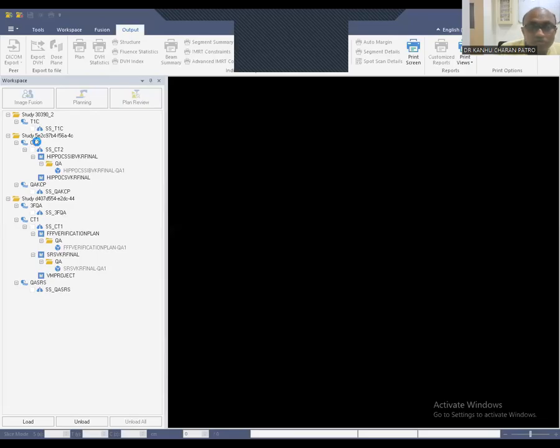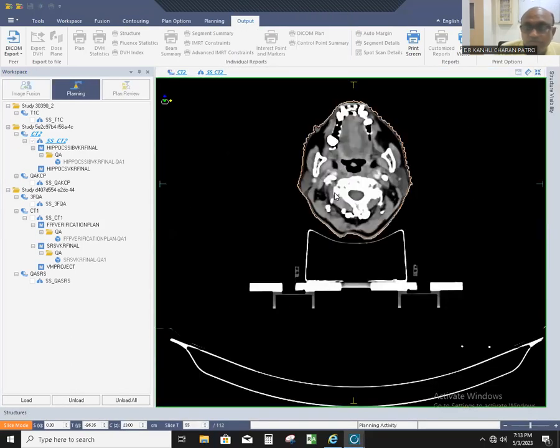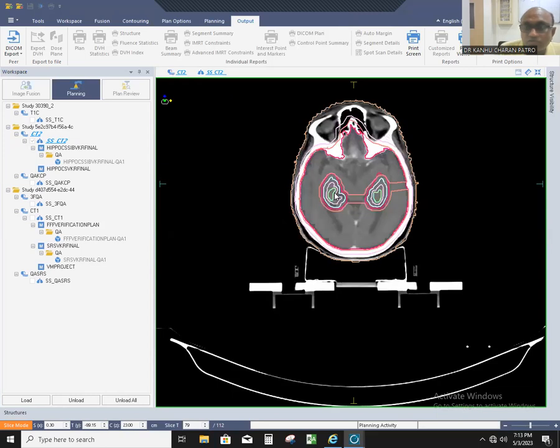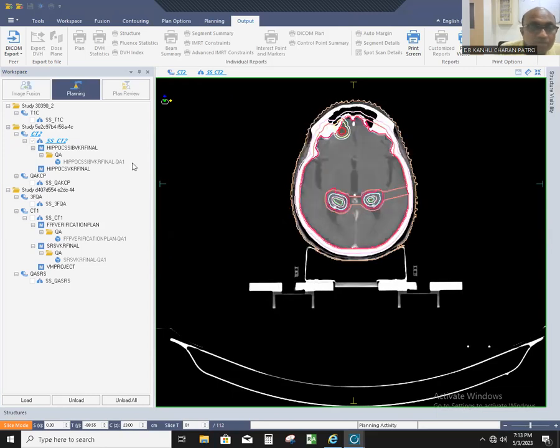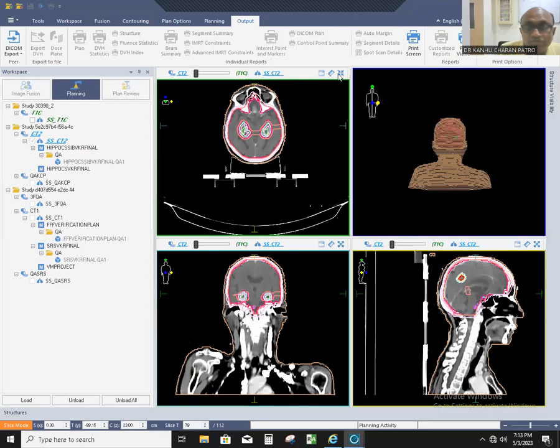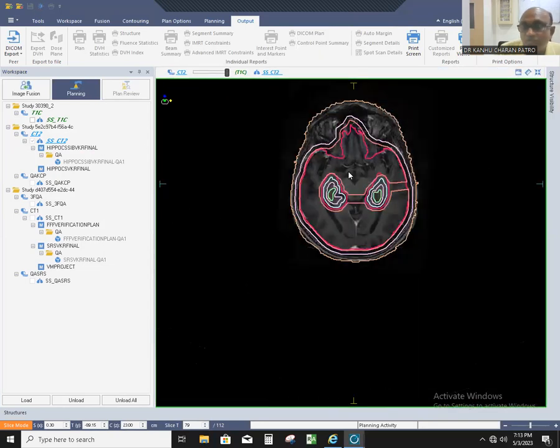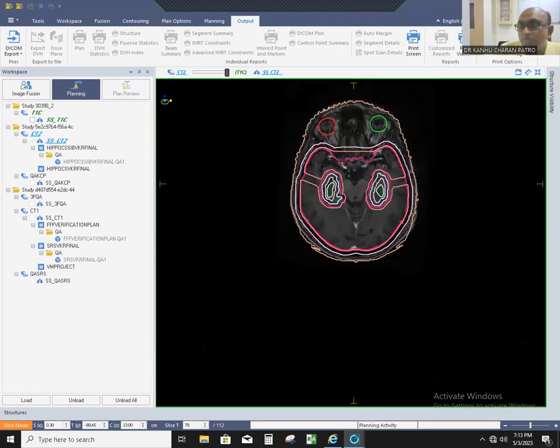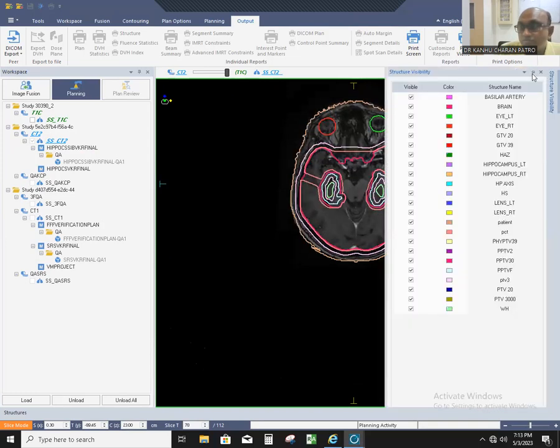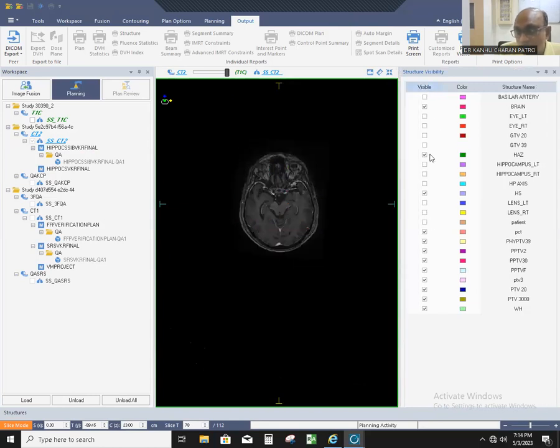You can see here this is our CT scan — the planning CT. Everything is contoured here. Now, you load the MRI as a secondary image set. This is the MRI where the hippocampus contouring has been done.